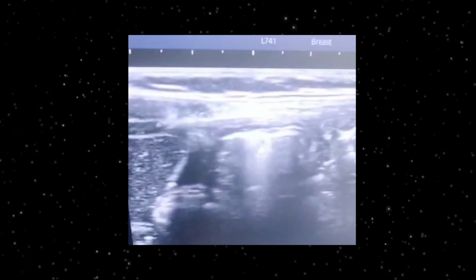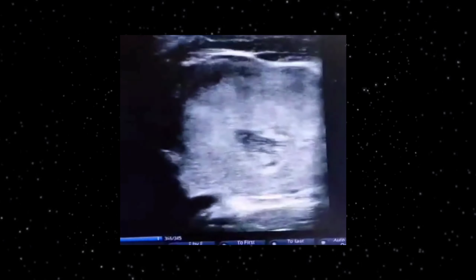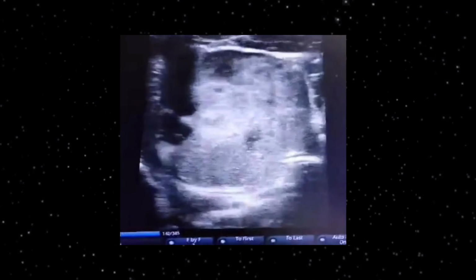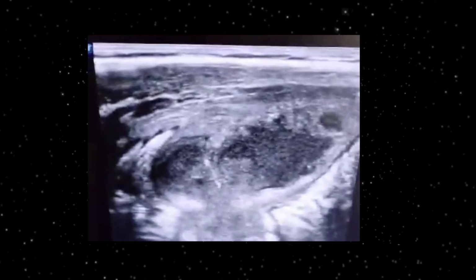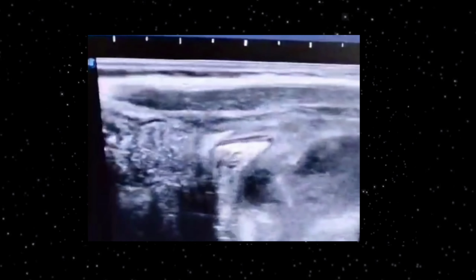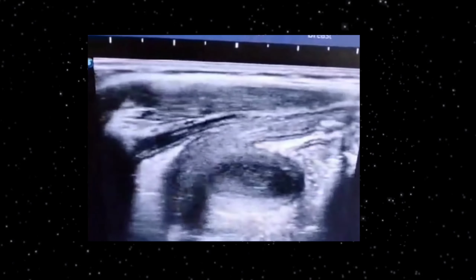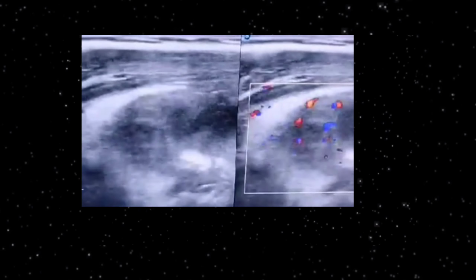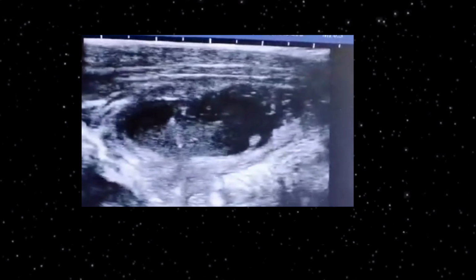Mind you that you should always survey the surrounding areas as well for enlarged lymph nodes and any other collections. Here this surrounding area is also visible, where you can see the fat strandings or surrounding tissue stranding. Here if you focus on, this is a particular bowel loop. You can see the bowel loop is there, but if you come out of this bowel loop, you will appreciate that on the top of it in a longitudinal fashion, you can see the surrounding small areas of collection are visible.